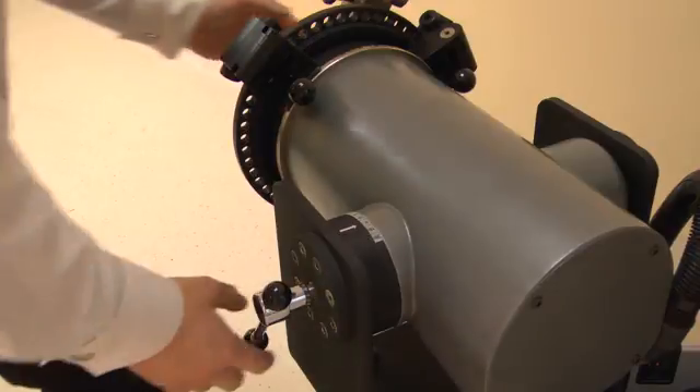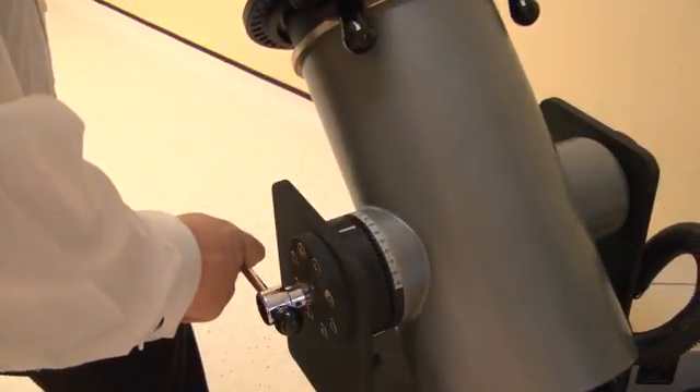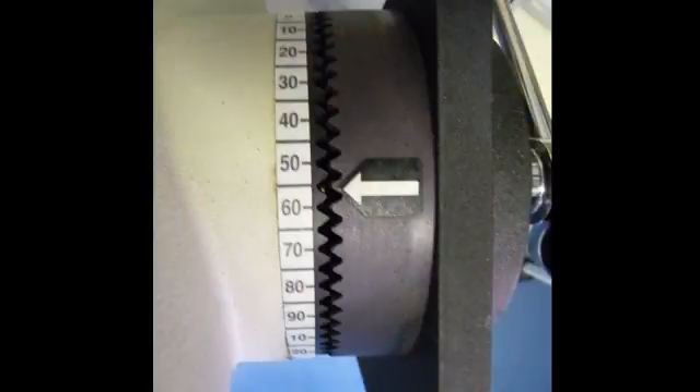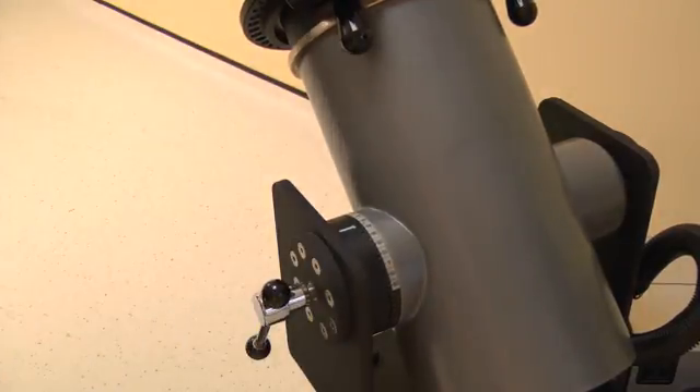Now set the dynamometer tilt. Release the locking handle then change. For inversion/eversion, adjust the tilt angle to 55 degrees. Lock by tightening the handle.